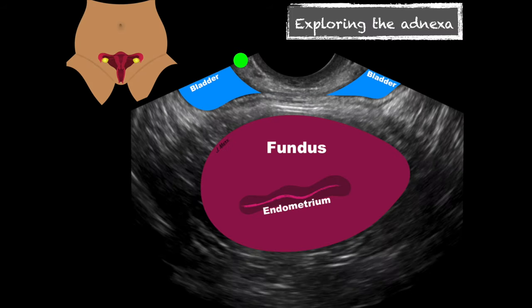Now we get to the more difficult portion: finding your ovaries. It's not always possible — even great sonographers are going to struggle. Bowel gas gets in the way; you don't always find these. We're going to try to identify what we can and watch for any abnormal structures. I like to come back to the fundus view we had before and start here. This is where I have the most success — staying in short axis at the fundus level, then angling over towards my right and left looking for that adnexa.